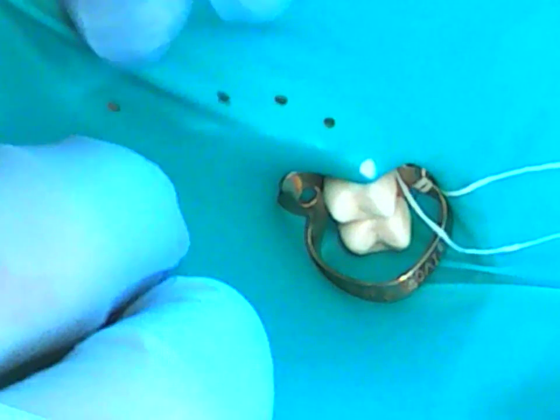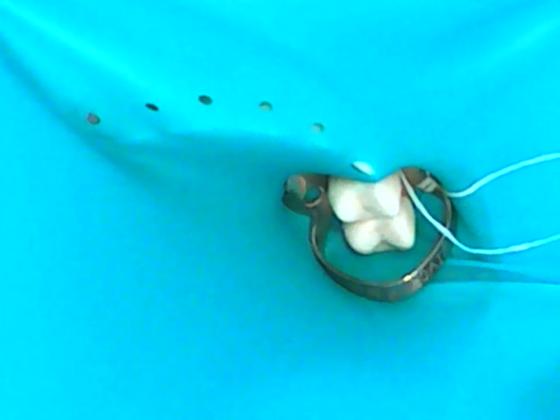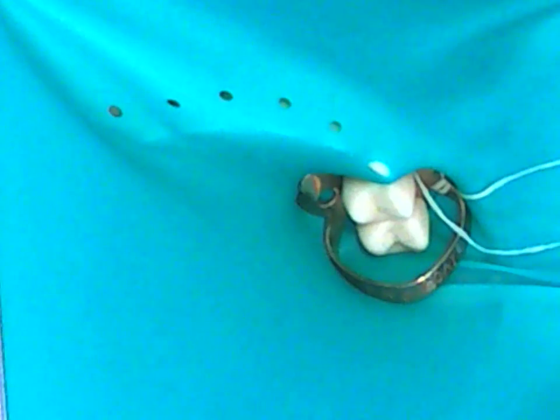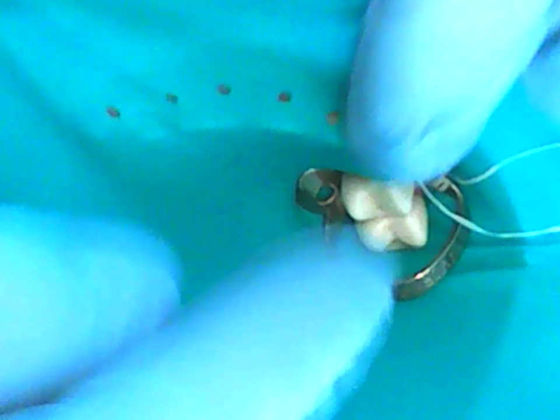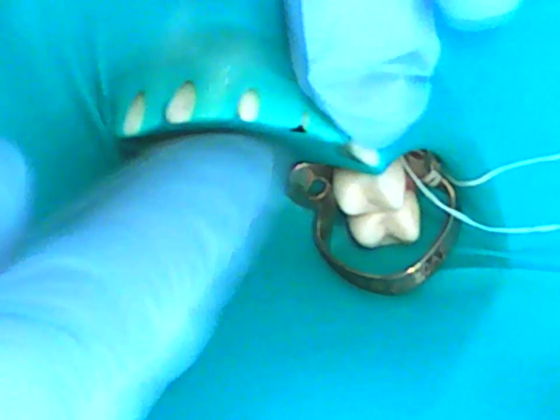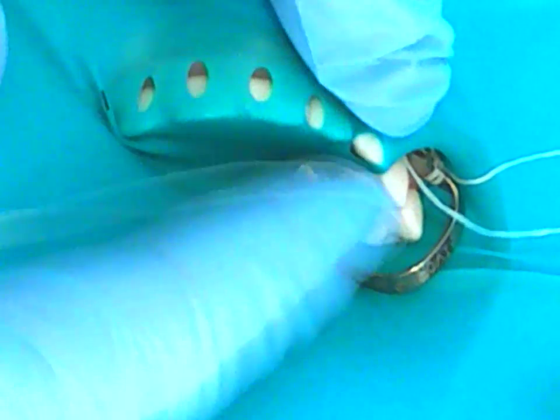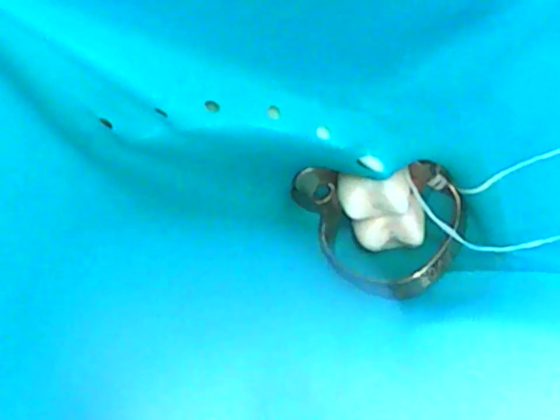Okay, so you are now exposed to that area. We're going to then isolate the remainder of the teeth by stretching the dam over each tooth, the mesial and distal areas. The idea of this is just to get the dam through your contacts. I want to line it up appropriately, make sure I have the teeth orientated with the holes. So 3, 2, 1, and 1, 2, and 3. Yes, I have them all, so that's good.